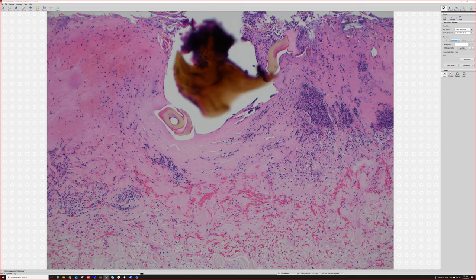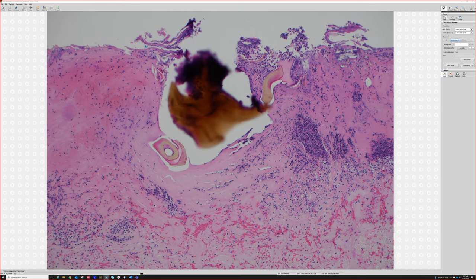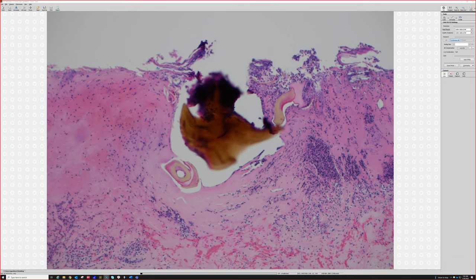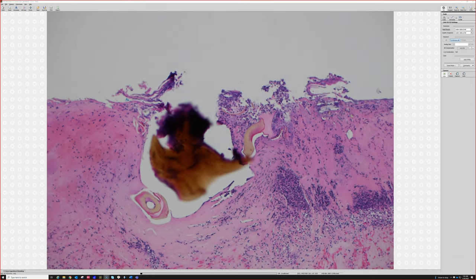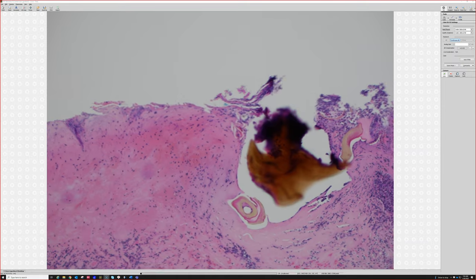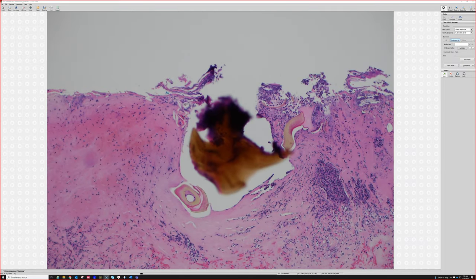You could still say it's suggestive of an arthropod bite and could be a tick even without seeing a mouthpart. Stingers from a bee or wasp that are embedded — I've never seen one in my practice — could look a little similar because they're also chitin, though they have some barbs on them. Other things like scabies, bot fly, or tunga — the penetrant sand flea — all have similar chitinous exoskeleton, but with different shapes and locations. Scabies is much smaller and sits in the stratum corneum. Tunga is about a hundred times bigger and in a similar location but massively bigger than a regular punch biopsy. Bot fly is also much bigger.